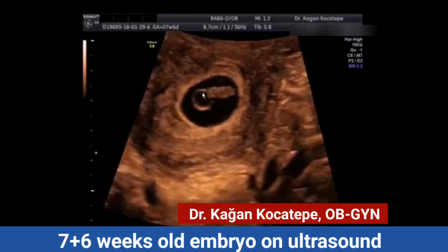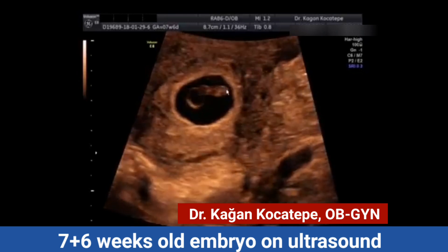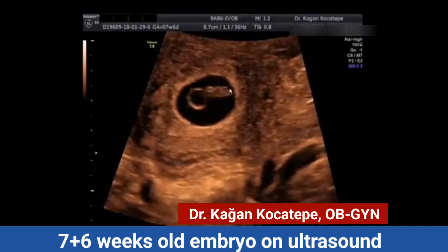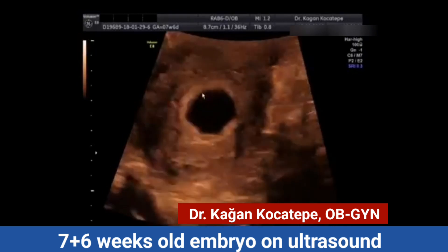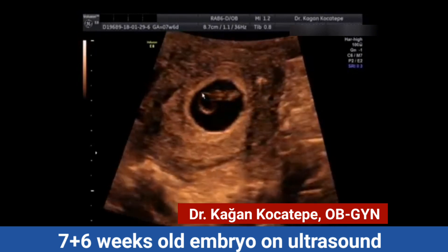Now we are going to measure the whole body of the embryo — not the fetus. The term fetus applies after 10 weeks of gestation.